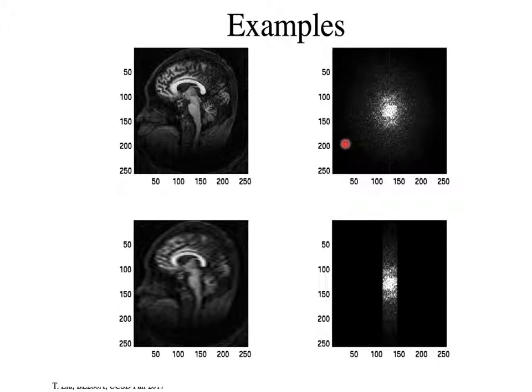One way of decreasing the time it takes to make a picture is to just take less raw data. So if we decided, let's cut out all of this raw data and all of this raw data, and just look at this central part, it's like 1/8 of the time. It seems like most of our signal power is here because it's highly concentrated in the center.